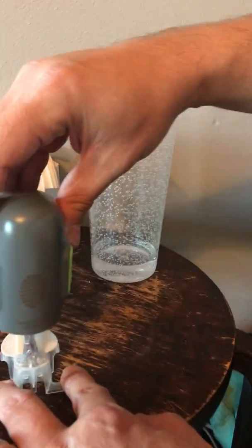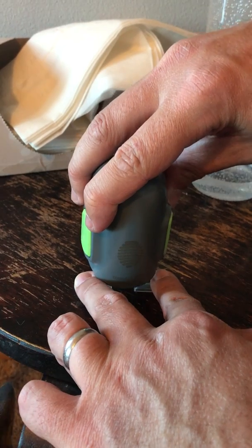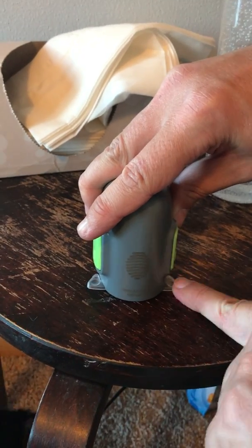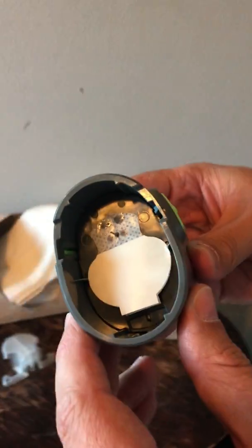So you're going to be taking that hole right there and putting it over the thing that sticks up, and you go straight down, not at an angle or anything. Straight down, and then you're going to pull up, hold those two little wings, pull up, and then you don't need that part anymore, and you'll know your success when you have it like that, and you'll be able to see the needle in there.